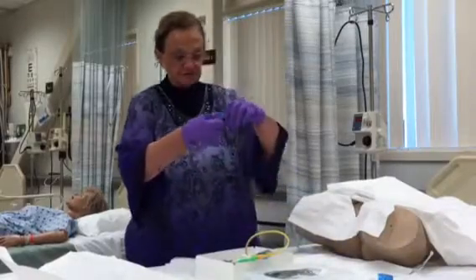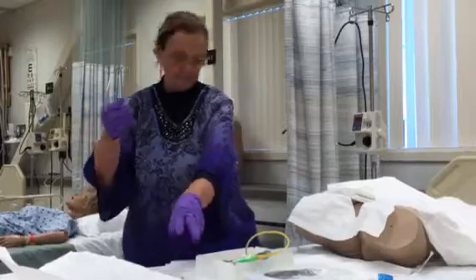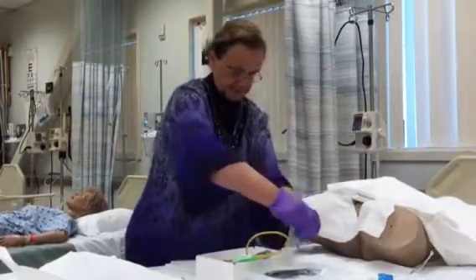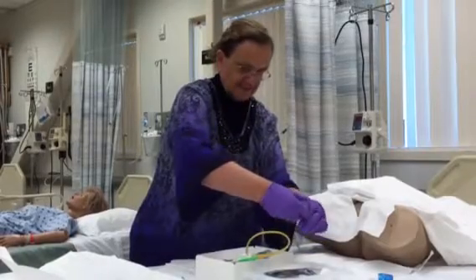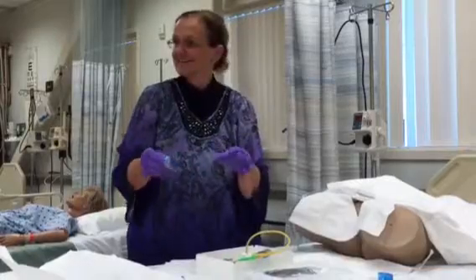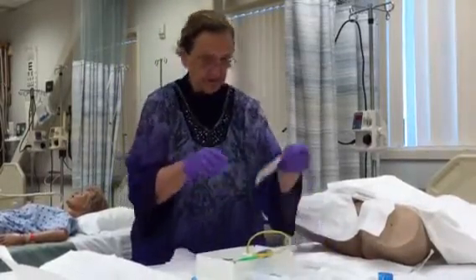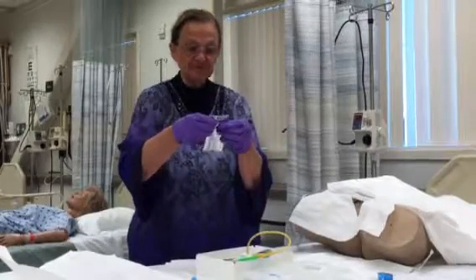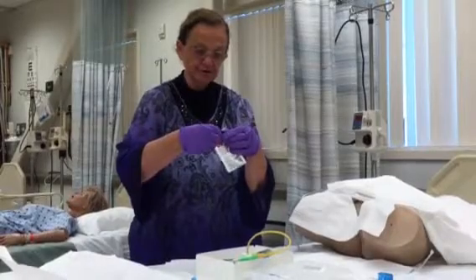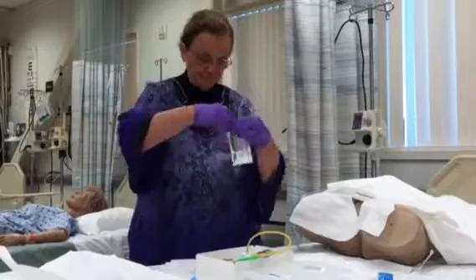And then what I'm going to do is open up my lubricant, and I'm going to pour it in my tray so I can goop up my catheter. This is practice stuff that's been used, so I don't know. Oh, I did get lubricant, yay. And anything I'm done using, I just drop. I then am going to open up my betadine. It says tear, pour here. I see it now.